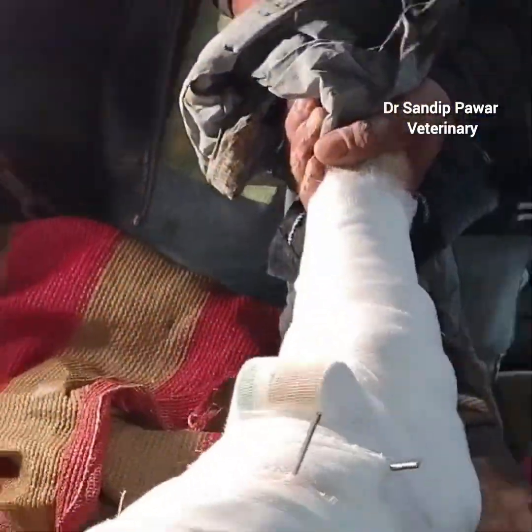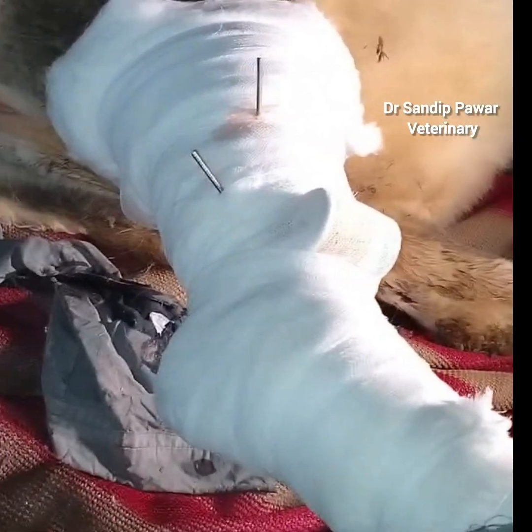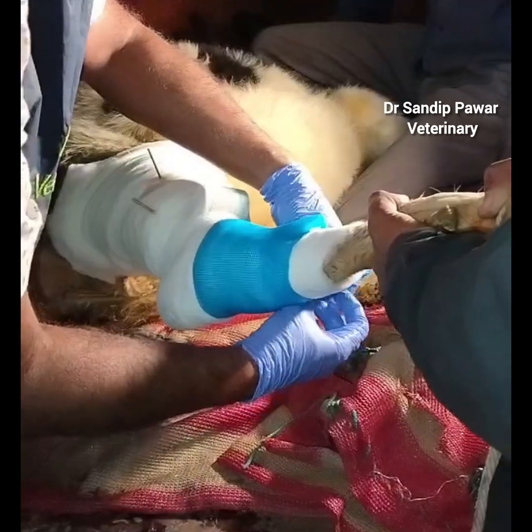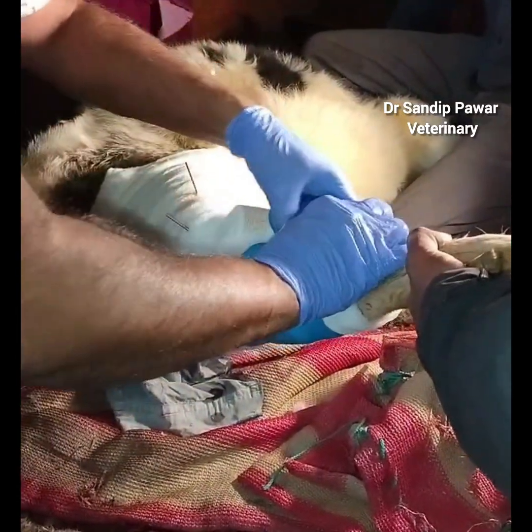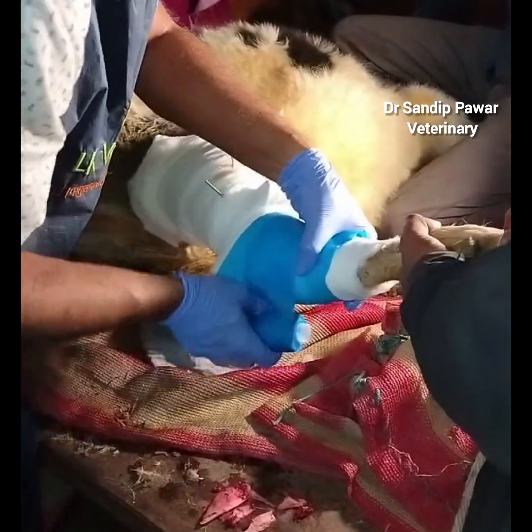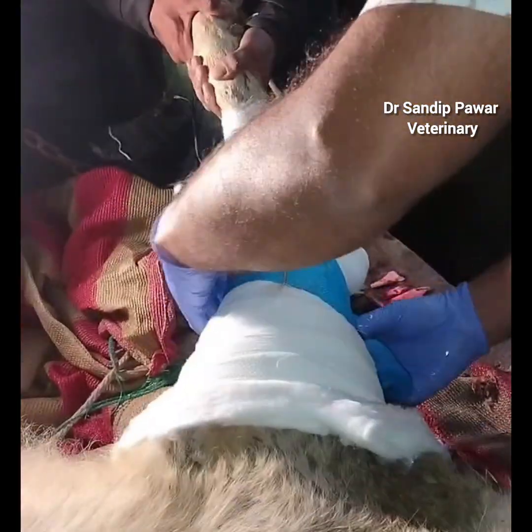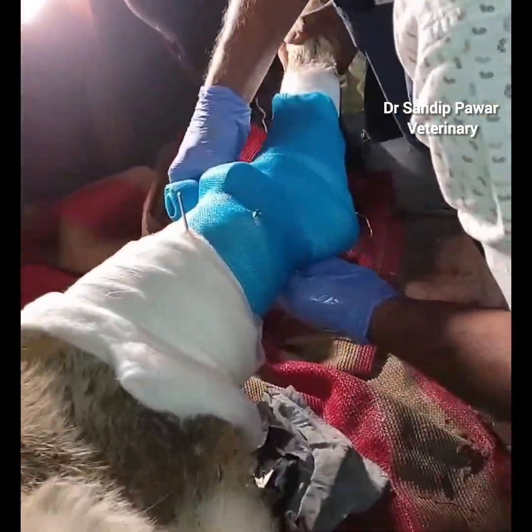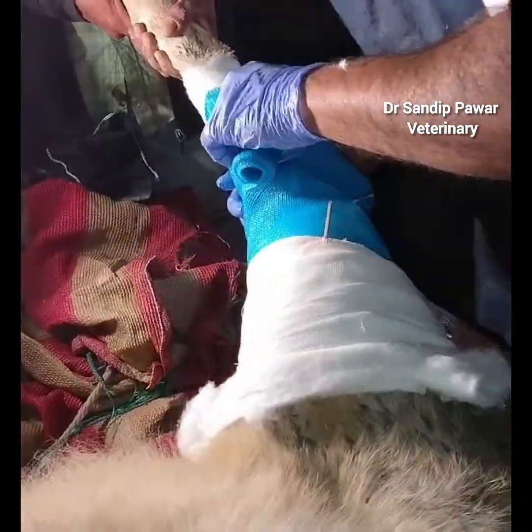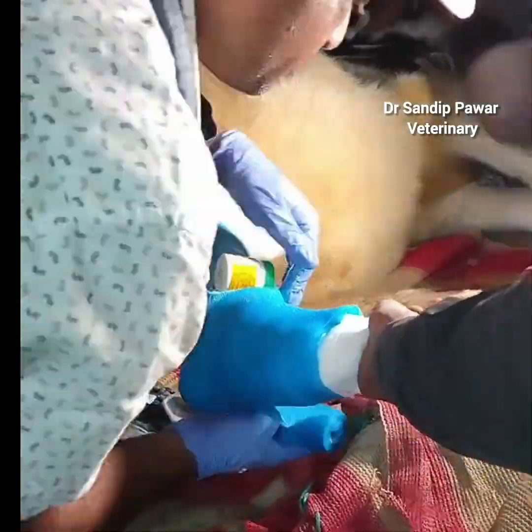Two 3.5 mm Steinmann pins were inserted into the bone fragments to stabilize the fracture. After proper alignment and bandaging, a fiberglass cast was applied covering at least two joints of the tibia. The cast included a window for wound care, and precautions were taken to prevent injury from the cast edges.